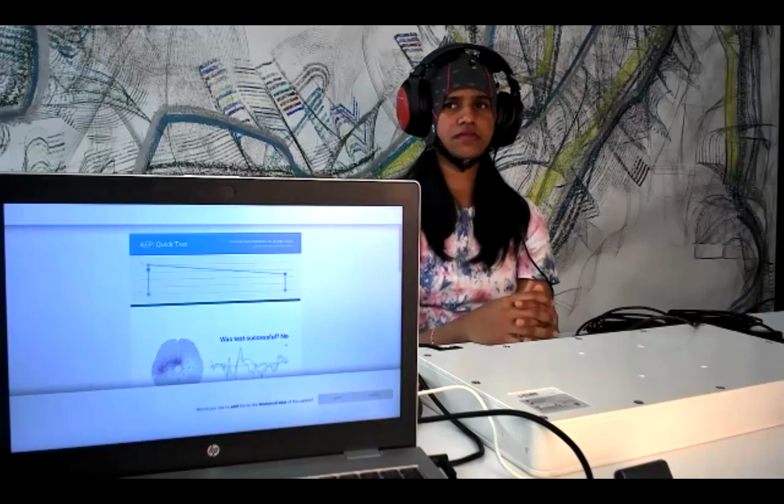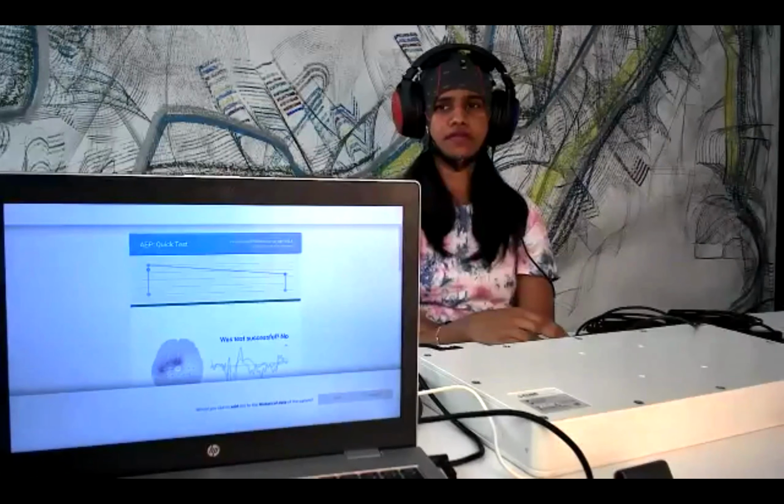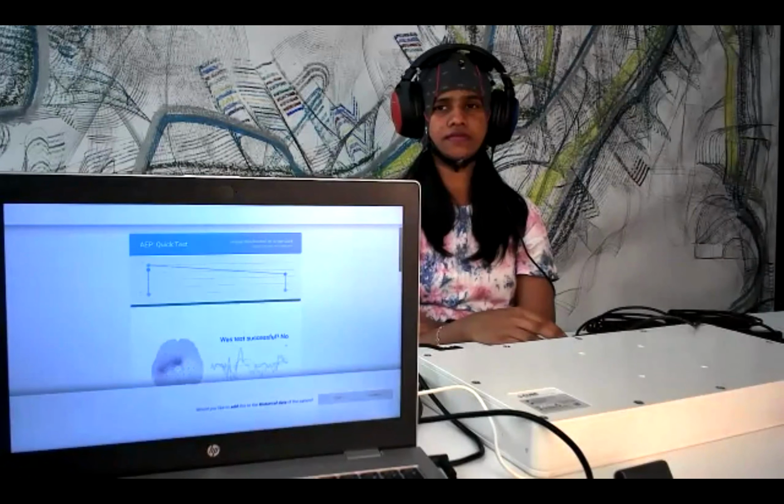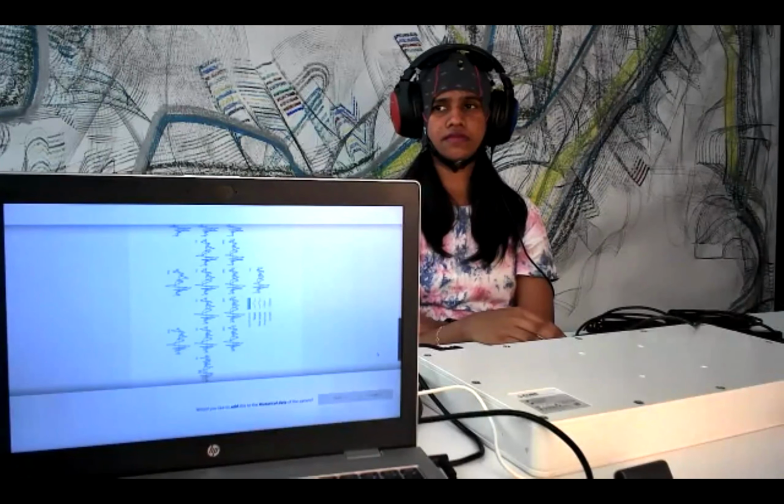Okay, so unfortunately the quick test was not successful, although you see the progress bar is moving almost all the way to the right. But again, I think the signal to noise ratio is not perfect, and also the accuracy is not very high in this case. So that's why it was not successful.